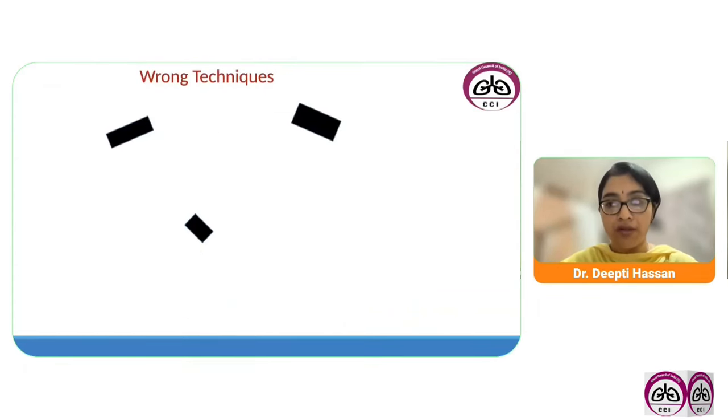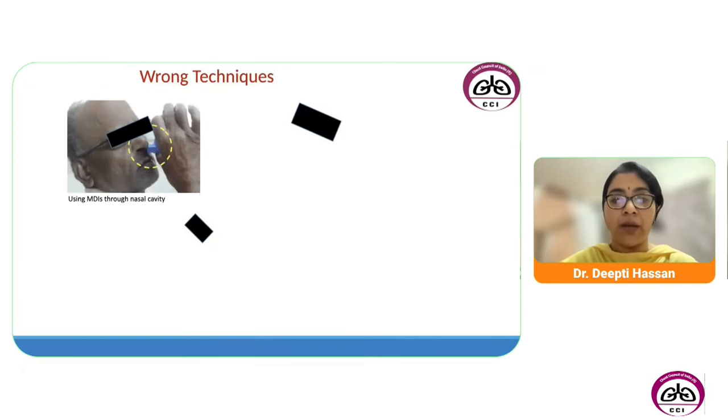So here are a few wrong techniques which were noticed. Number one, as you can see, using an MDI through the nasal cavity.